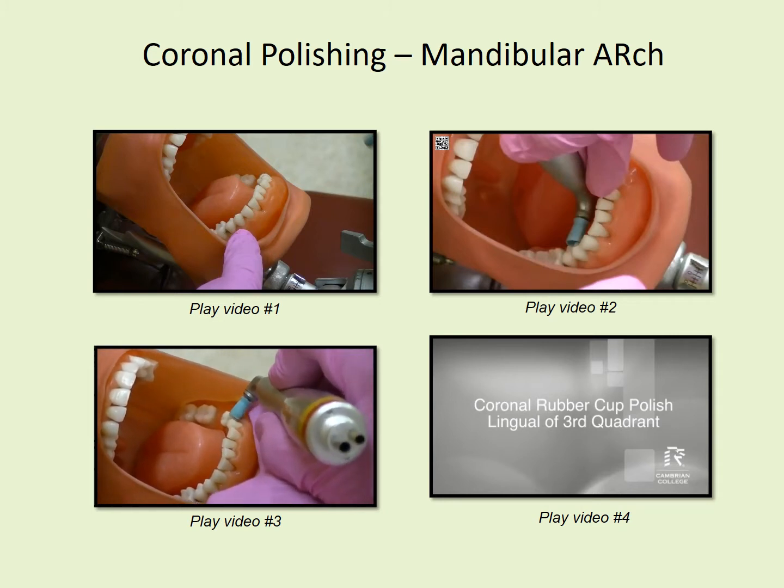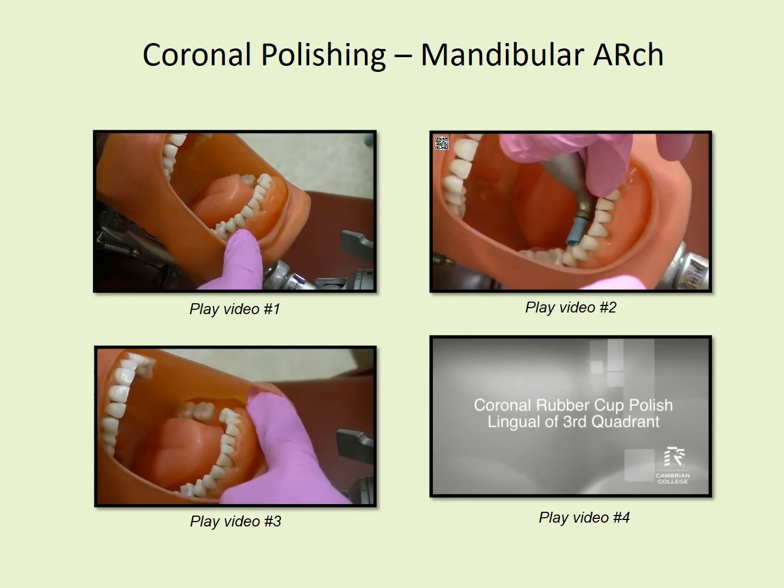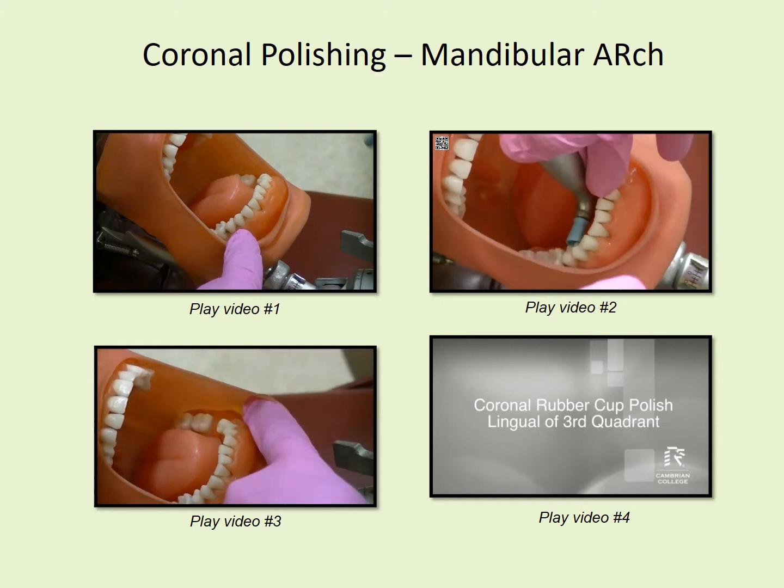And maybe up to the mesial or so of that premolar. If the mesial of the premolar you can't reach, you can move your position this way to get that mesial side better.